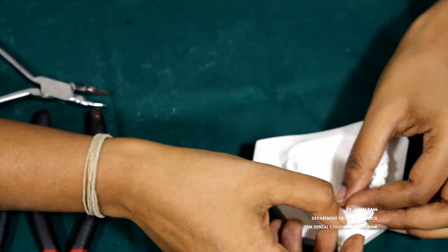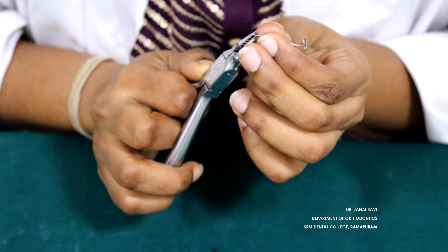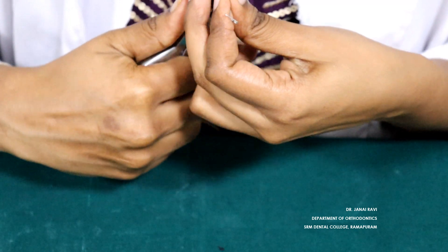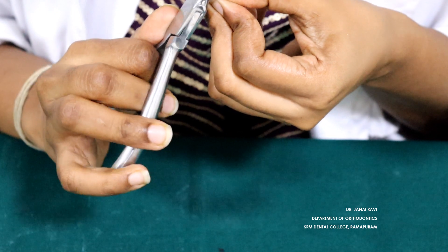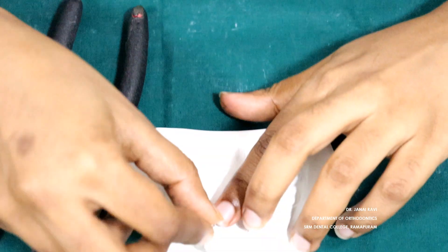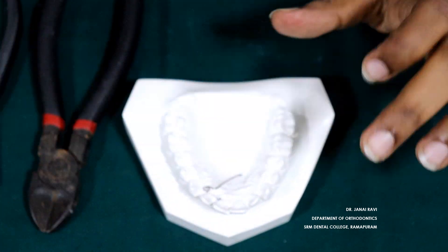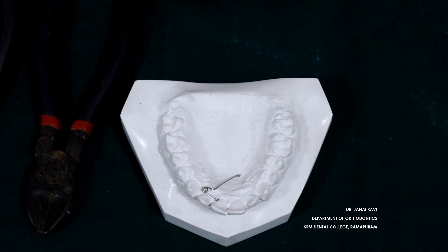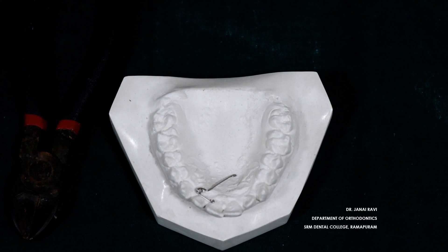This will be incorporated into the acrylic. Give a retentive tag on the end of this wire. That's it — a single cantilever spring is done. We activate it by opening the coil, which will keep pushing the tooth to the buccal surface.